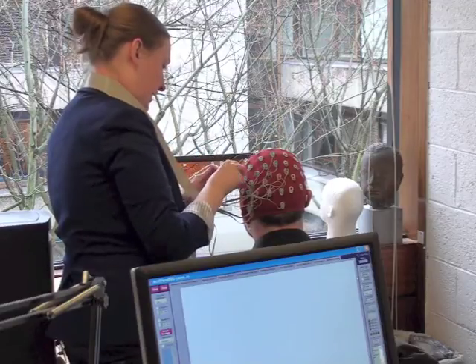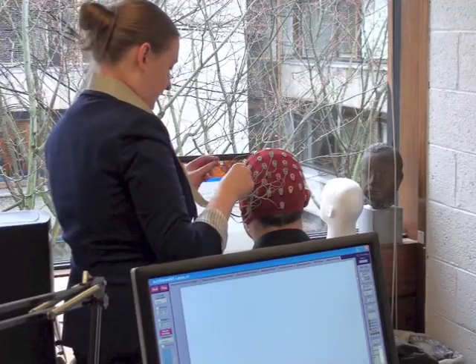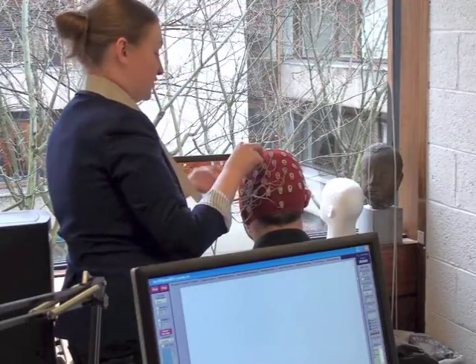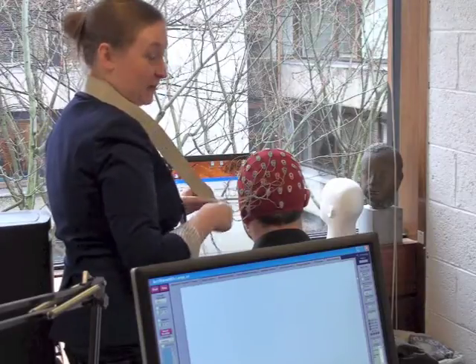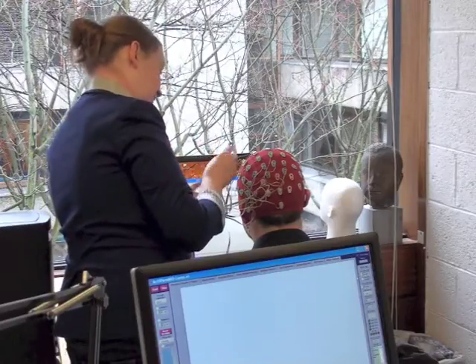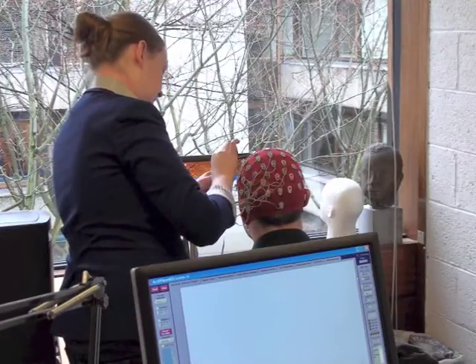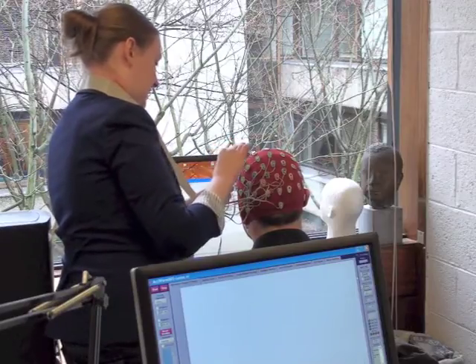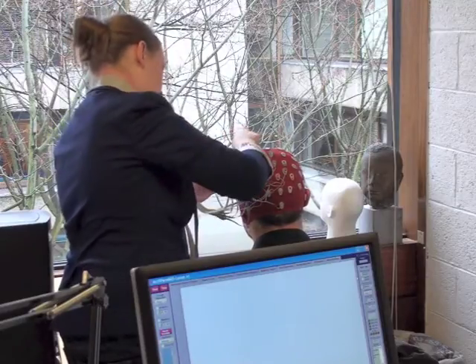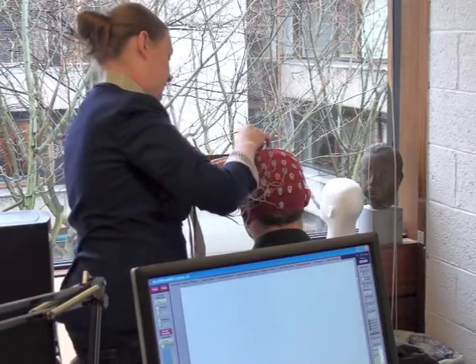When you get to know the brain, or if you're doing EEG, you're going to be interested in the brain, and the electrodes are all labeled like CP3, where C is for central, FC is frontocentral, T is temporal, and P is parietal. They're labelled very clearly. It's hard to make a mistake as to what you're doing, and you just plug the correct one into the correct hole. So you're matching colours and numbers. Exactly. Yeah, it's very easy. So again, this is only the left-hand side. You have to do it twice, and it's quite boring.